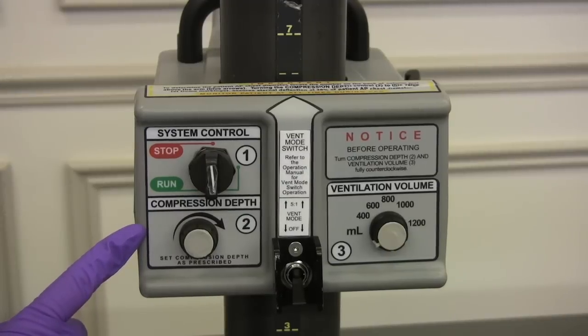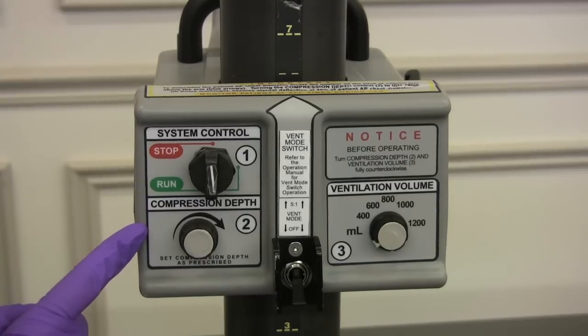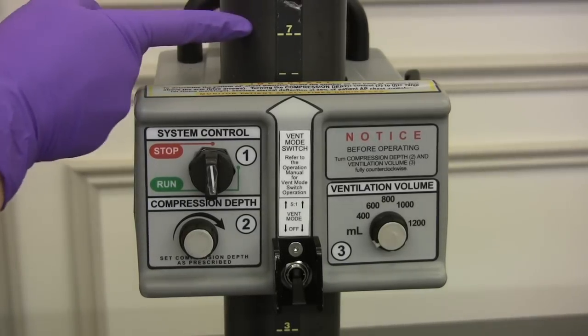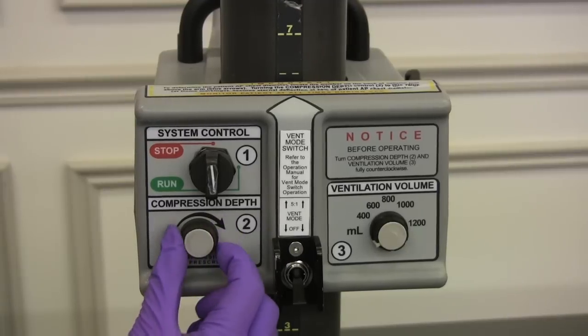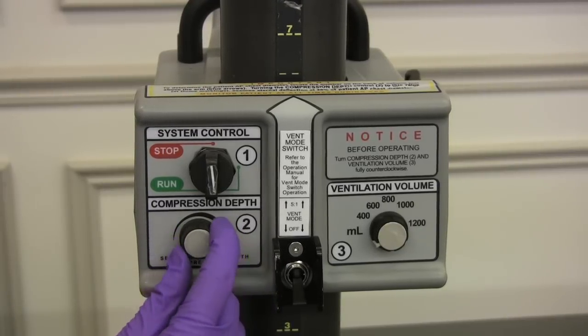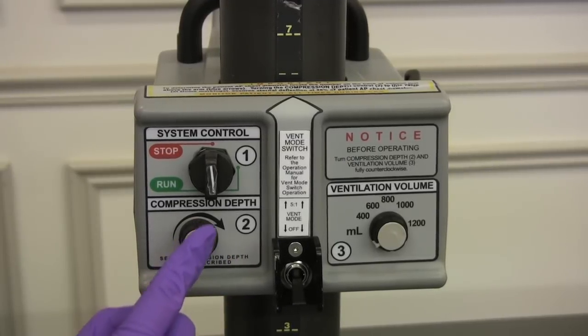The compression depth knob is responsible for controlling the depth of compressions on the patient. The depth of compression corresponds to the measured AP or anterior-posterior diameter shown on the back of the column. The compression depth is increased with a clockwise rotation and decreased with a counterclockwise rotation. When this machine is off, you always want to make sure that this is all the way counterclockwise.